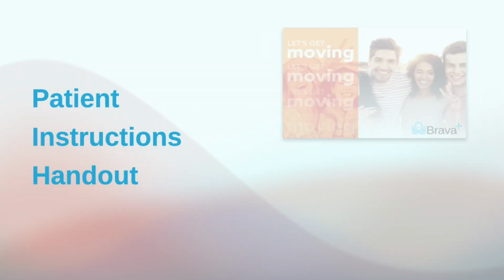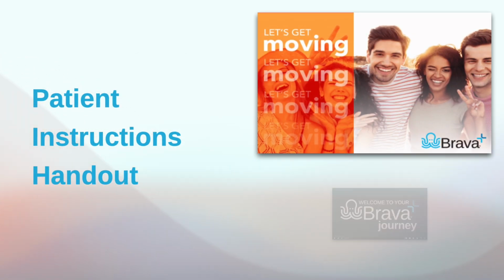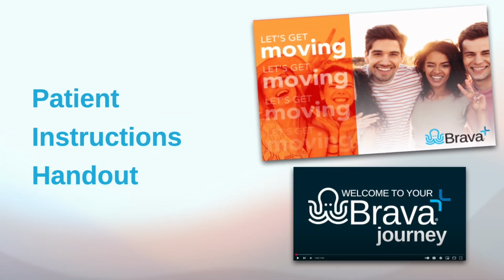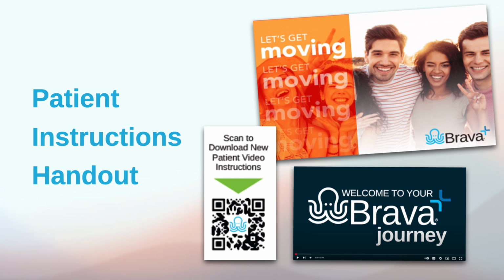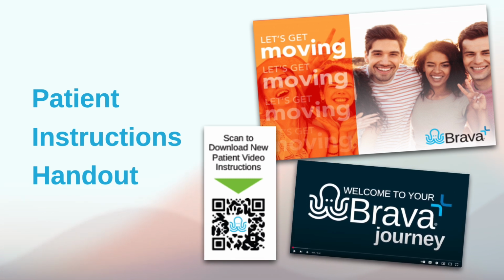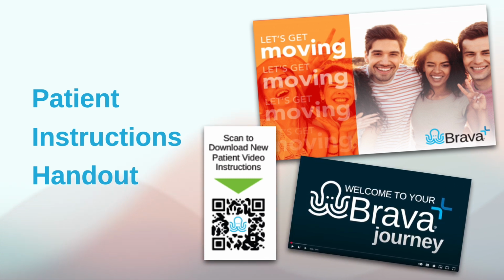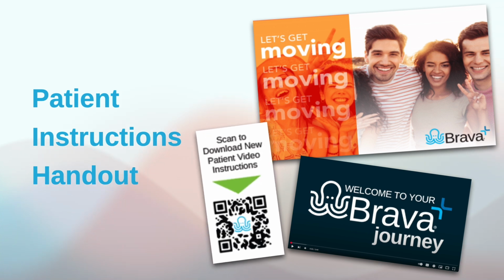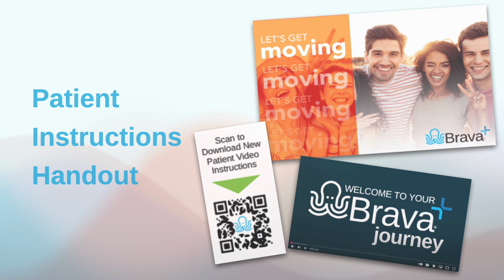Each kit includes printed instructions that are designed for your patient. There's advice on how to adjust to Brava, the importance of good oral hygiene, and how to properly care for Brava. A QR code appears on the back of the brochure, which takes the patient to an instructive video about their Brava journey. Make sure each patient receives this brochure at the end of their initial bonding appointment.